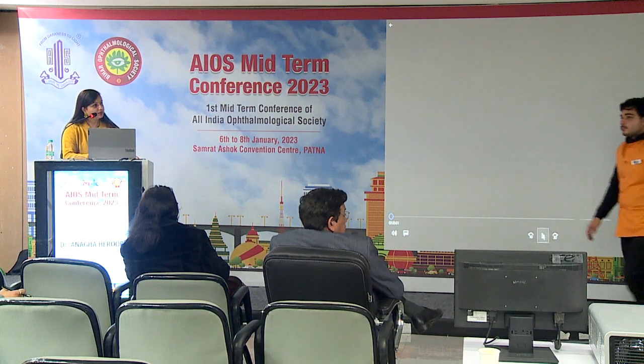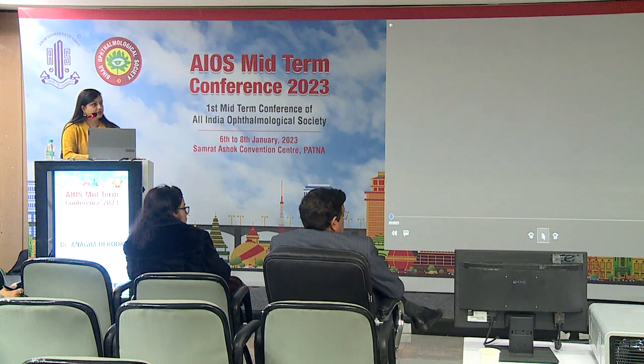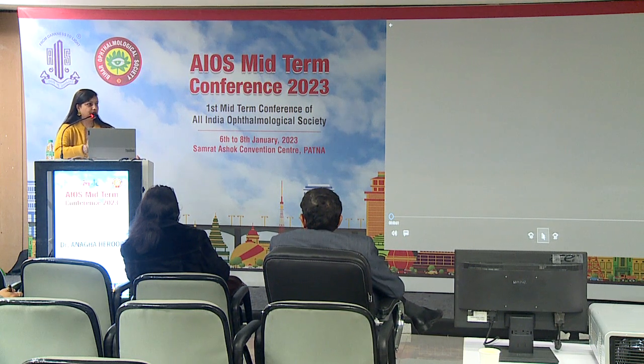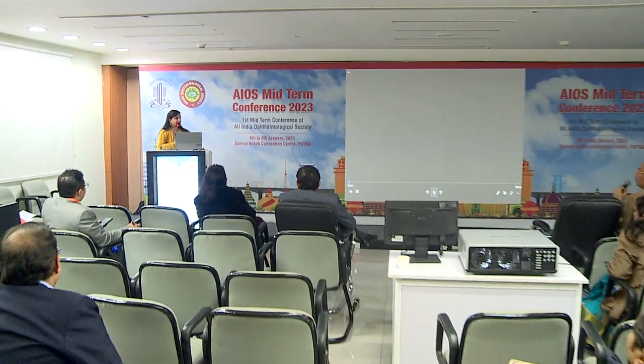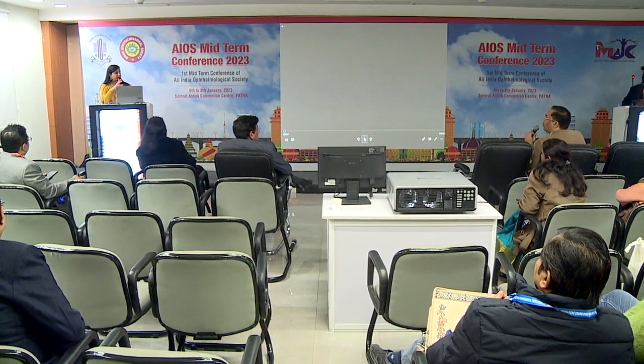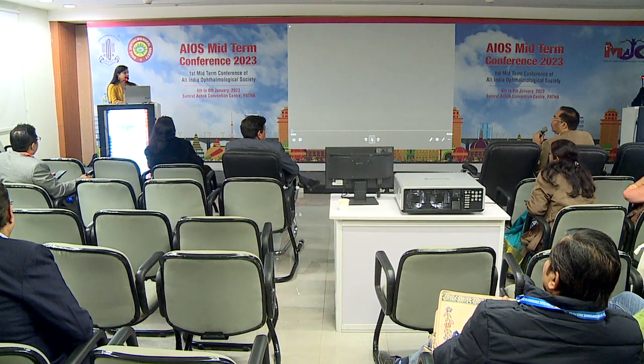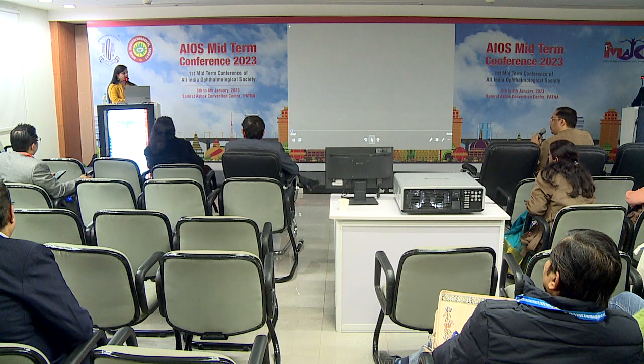And what are your views on EDOF IOLs in pediatric cataracts? See, in pediatric cataracts, it's a growing eye, depends on what age you want to do the surgery. But if it's, say, a 10, 12-year-old and you have a good, well-centered lens, and if there's no other problem like any subluxation or anything, you can still go ahead and use, but depends on other comorbidities also. If it's a traumatic cataract, if it's just a plain pediatric cataract, a good posterior capsule, then I think you can go ahead and use.